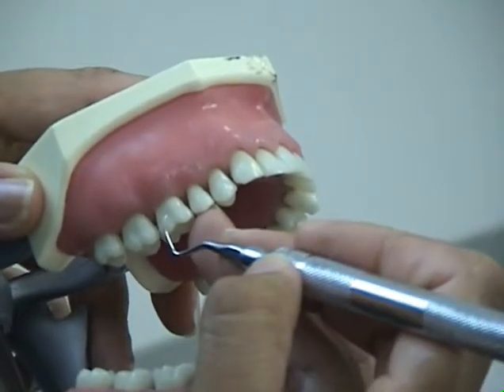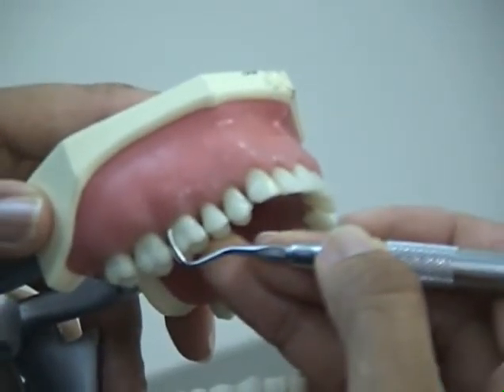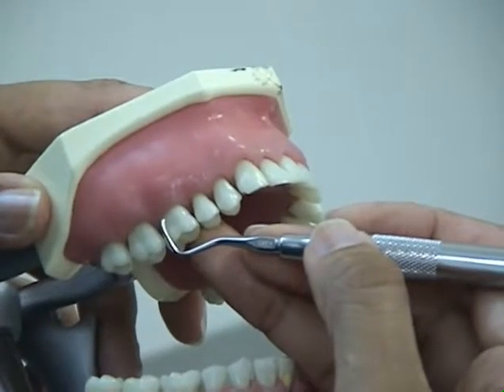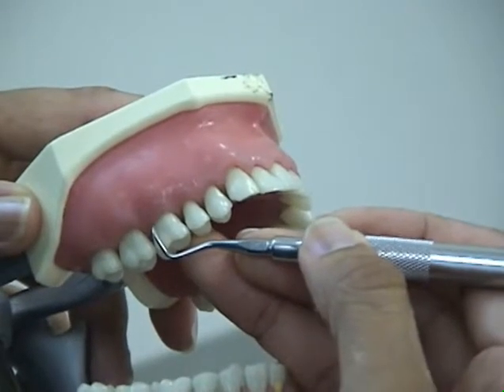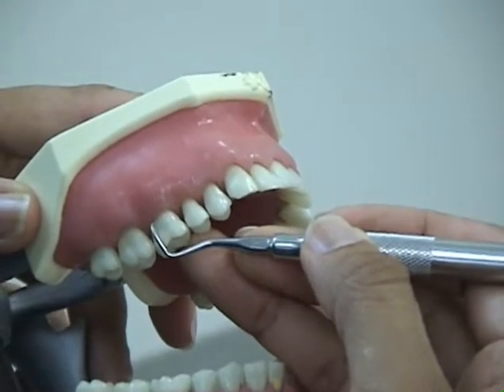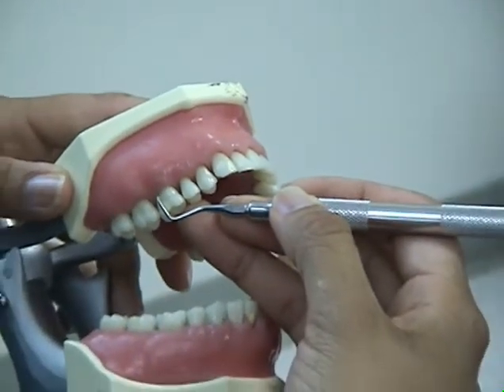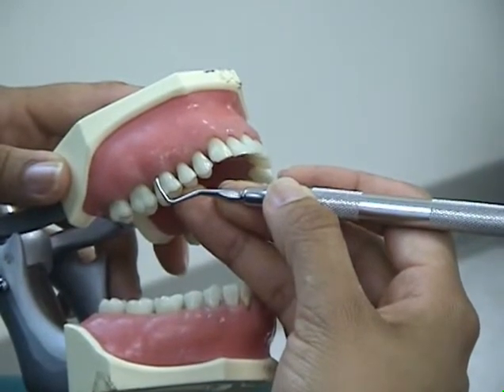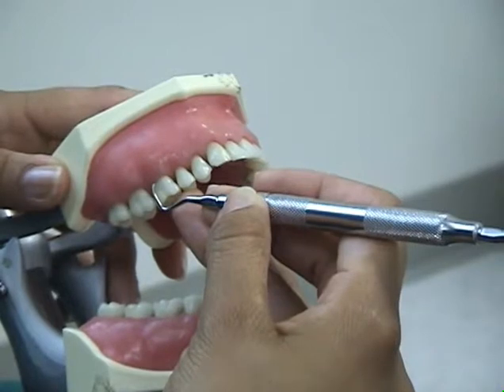Angulation of the curette is the angle formed between the face of the instrument and the tooth surface. For insertion beneath the gingival margin, the face-to-tooth-surface angulation should be between 0 and 40 degrees. To close the angle, lean the handle toward the surface so the face is almost against the tooth. To open the angle, lean the handle away from the tooth so more of the cutting edge is in contact.